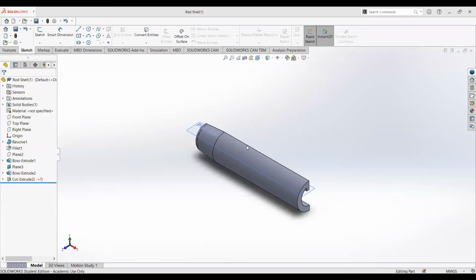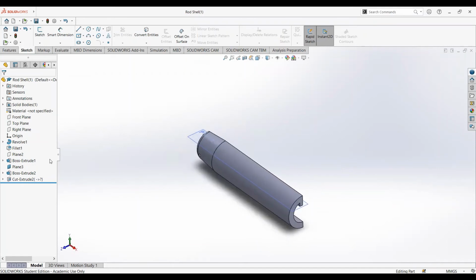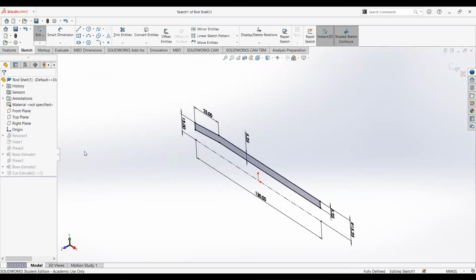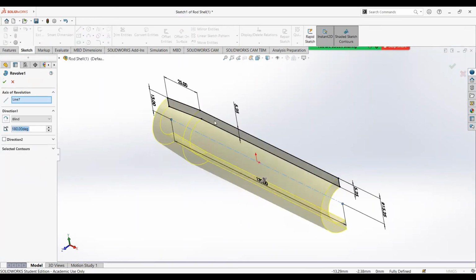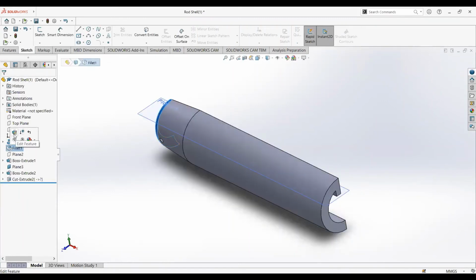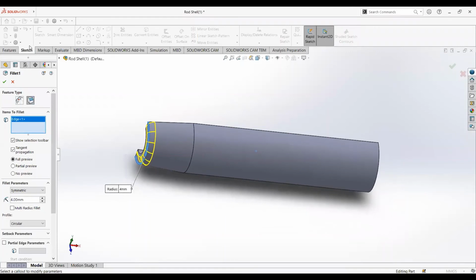So this is another part, which is the rod. It's like an outer shell for our device. So first we sketched this. And these are all the dimensions. Maybe I should zoom in and then you guys can see it more clearly right here. And then we used the revolve feature right here to give it a curvier shape, which was 180 degrees. After that, we used fillet right here, so there's no sharp edges and it's curvy like this.